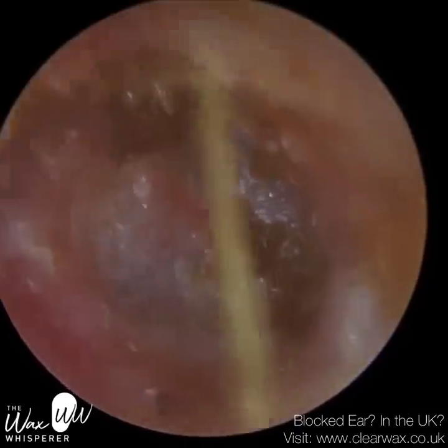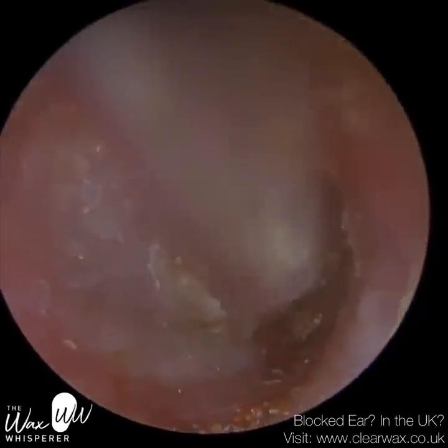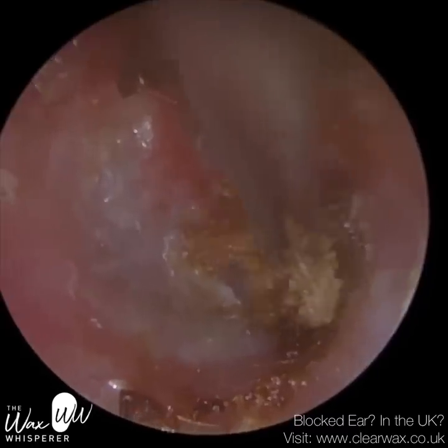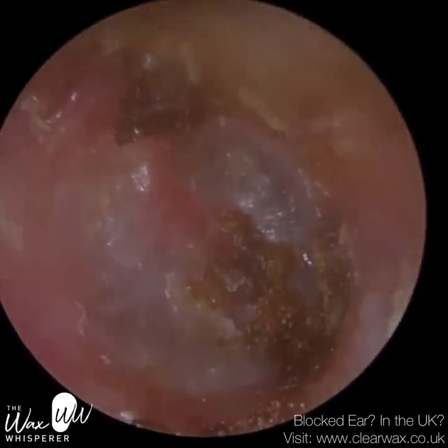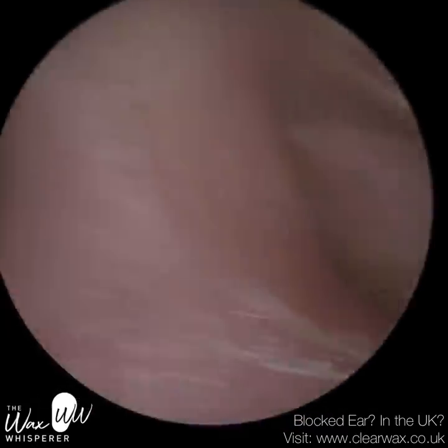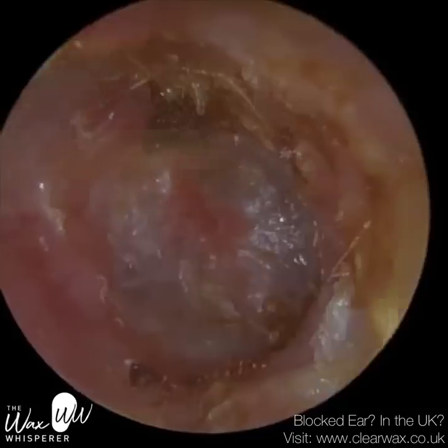Can you see the eardrum flexing in response to the suction probe, especially posteriorly? They have quite a thin eardrum, so we have to be careful. It's never happened to me — touch wood — but a very esteemed colleague of mine, an ENT surgeon, performed suction once and wasn't anywhere near the eardrum, but the eardrum had a very thin section from previous trauma. Although the sucker was about halfway in, it actually ruptured the eardrum, which got sucked in towards it. All was fine in the end — it heals. So here I'm just using the fine-end suction probe. Although the wax is very impacted, the extra power would be useful, but it's just too risky using the full-bore suction probe here. The fine end also provides more precision when working deeper in the ear, and if you do come in contact with the eardrum or the bony part of the ear canal it's less likely to cause trauma.